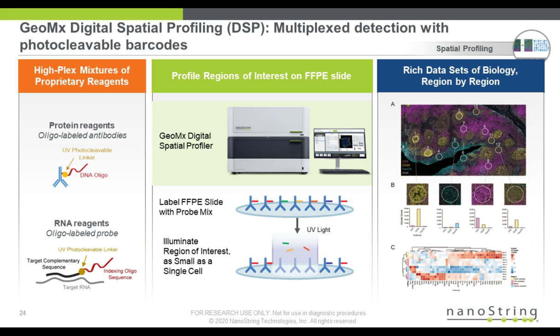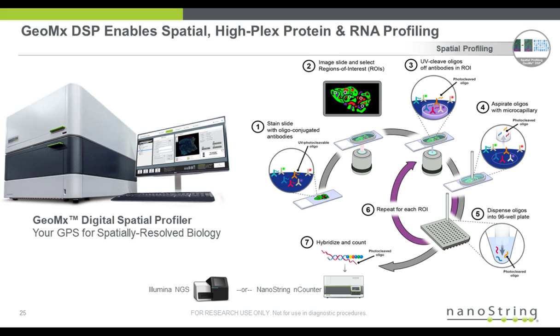But when I want to measure, and let's take Chris's example that you're going to hear about in a few minutes, if I want to take 2,000 mRNAs and know what's happening exactly in that tissue for 2,000 mRNAs, I can actually go there. I will have 2,000 invisible mRNA FISH probes here. I go to that region of the tissue. I shine the UV light. All the little photocleavable sequencing barcodes are released from that tissue slice, and you literally drink them with a microcapillary that sits right over the tissue slice. And then that generates what I call a digital replica of the affinity reagent as a function of space.